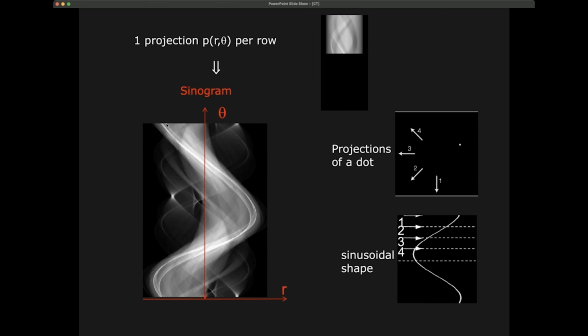So this is a complex object that had a very high absorbing dot somewhere asymmetrically. And so we see here that this high projection is from one specific dot, the other high projection also, and you see some more. So you see some with a high absorption, and then you also see many lines with lower absorption. And you see the outside, so you see that here the outsides are black, which means that there is like a circle of air around.